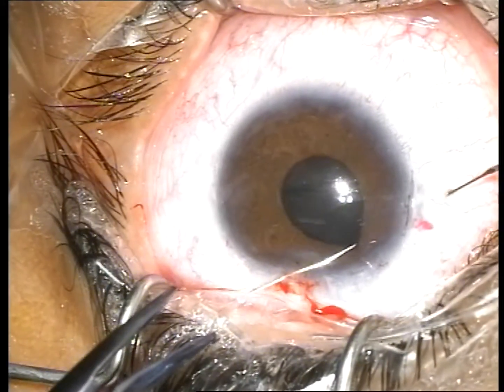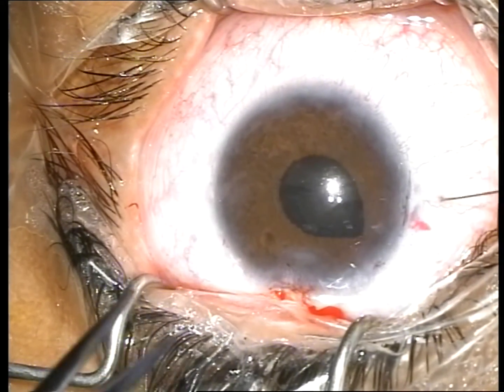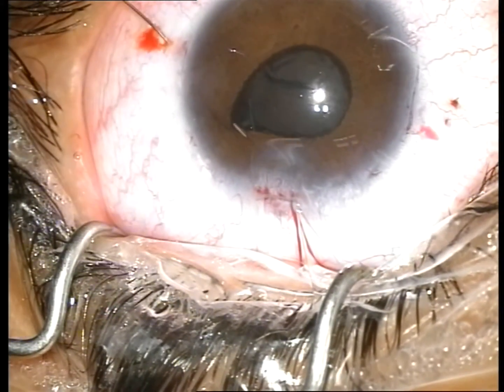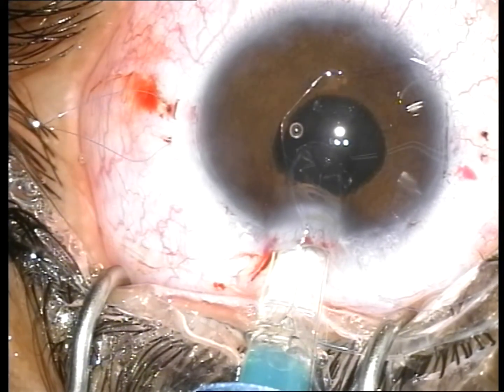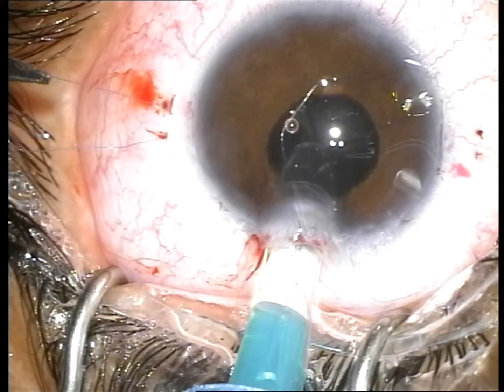Both needles extending from the trailing haptic are inserted through the main incision, docked into a 27-gauge needle, and removed externally through the scleral pocket at the 9 o'clock position. The same action is performed with the needles extending from the leading haptic at the 3 o'clock position.